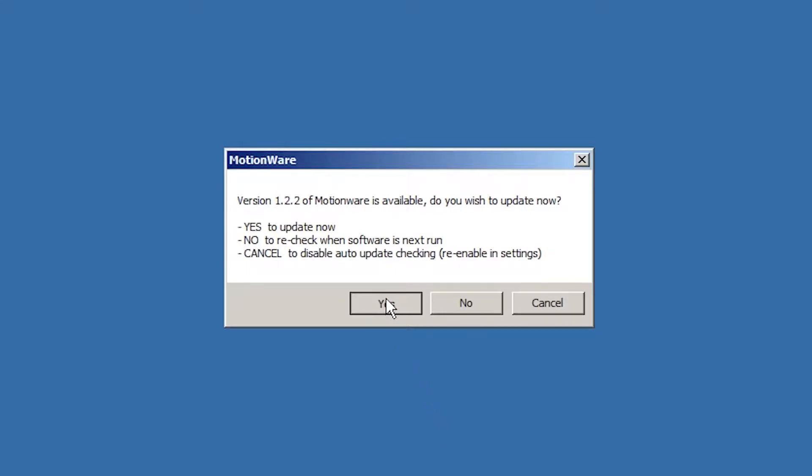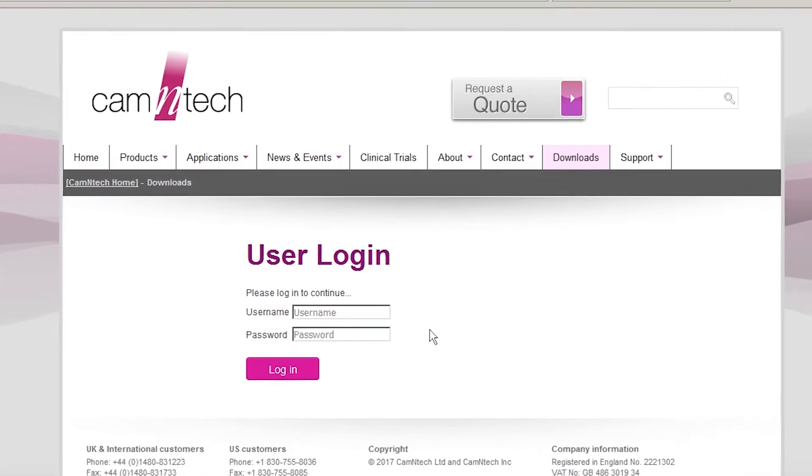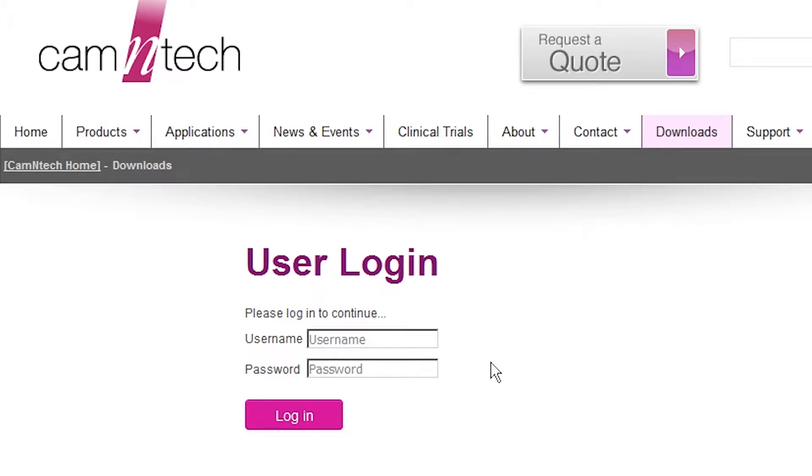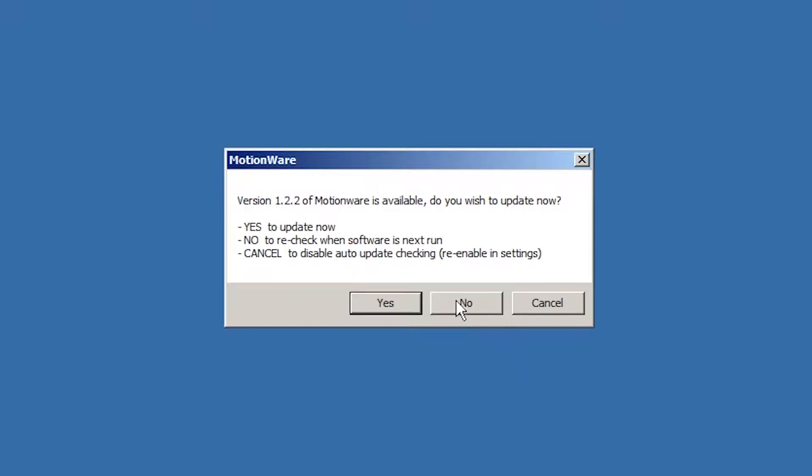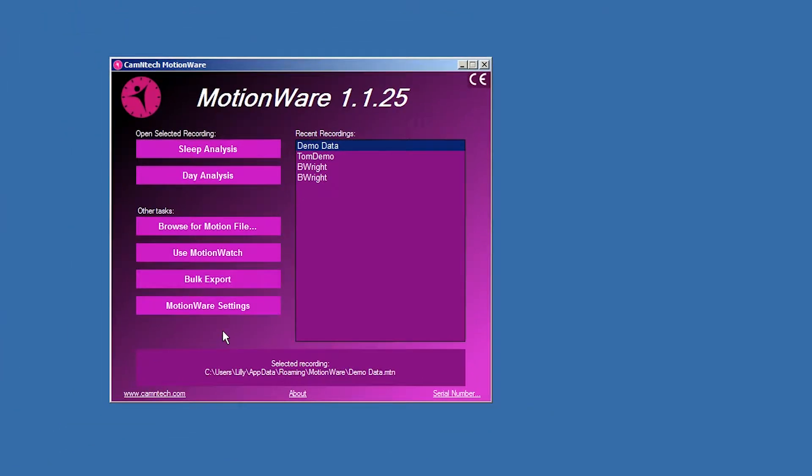Click Yes to visit the Camentech website, log in, and download the new version. You will require a valid username and password. Click No to ignore this message.